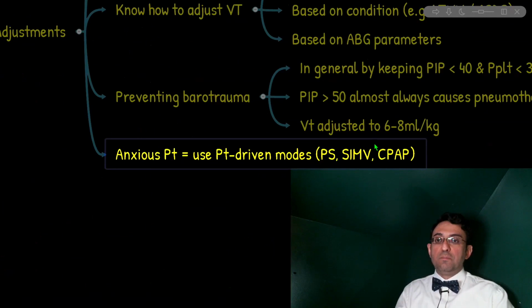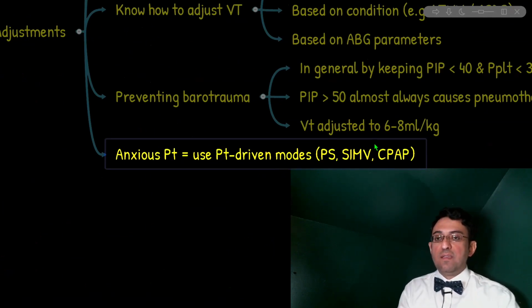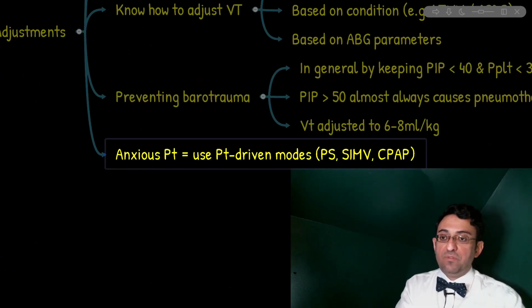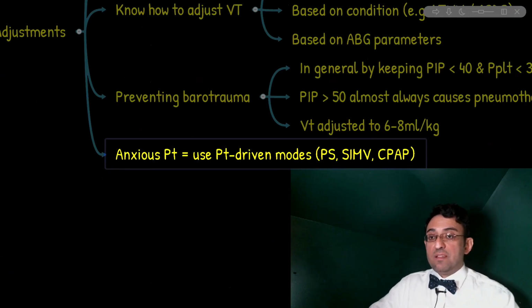They include pressure support ventilation and SIMV, synchronized intermittent. Also add to this CPAP. These three modes provide the highest level of comfort for the patient. Now, regarding preventive measures, how can we avoid intubation-induced bronchospasm? We either use lidocaine or aerosolized beta-2 agonists prior to intubation. Important question, true or false, in order to prevent infectious complications, frequent changes of tubings of mechanical ventilation is recommended. That's false. Frequent changing of tubing is not preventive but permissive for infection.